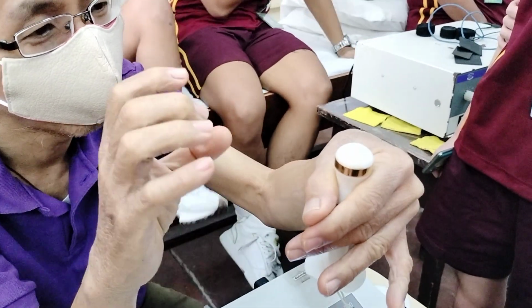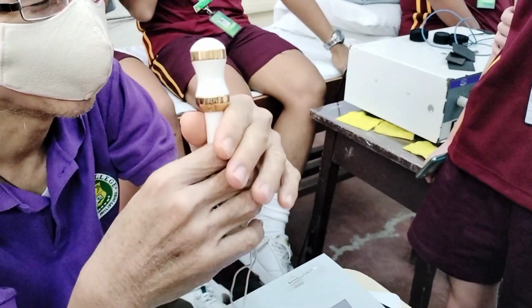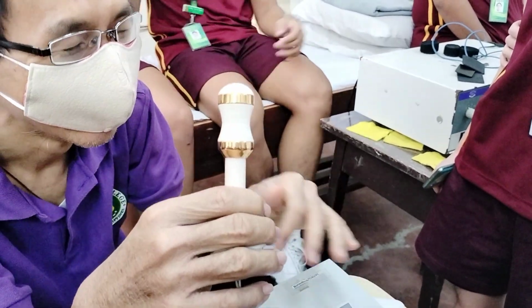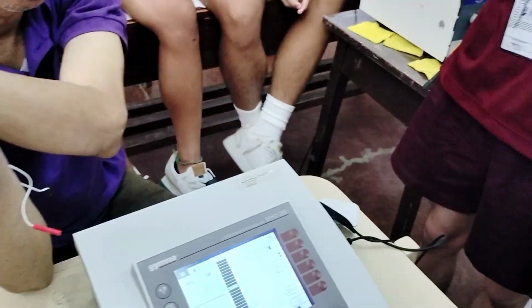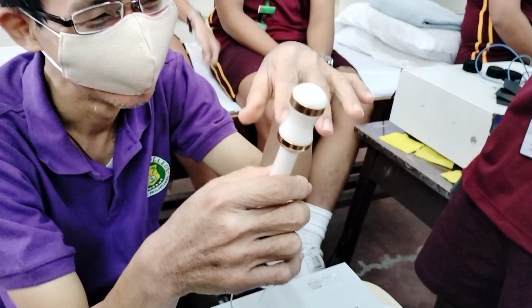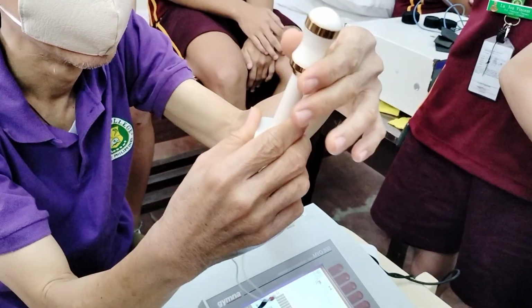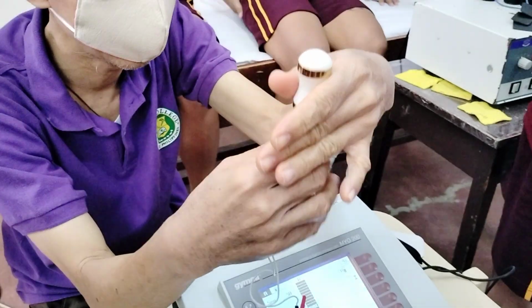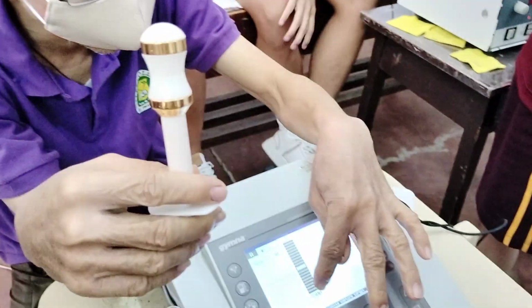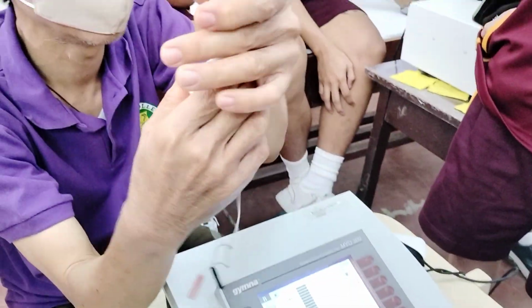You try to apply pressure on the device. Of course, you have to tell your patient to defecate first before you do this. Schedule it, and the patient should be fasting before doing that. Then tell the patient, ma'am, I want you to apply the pressure, and then you will see your bar go up and relax down. This is a sample of the pressure.